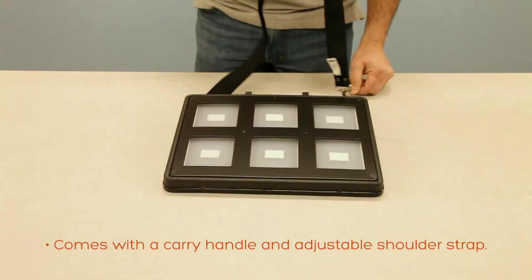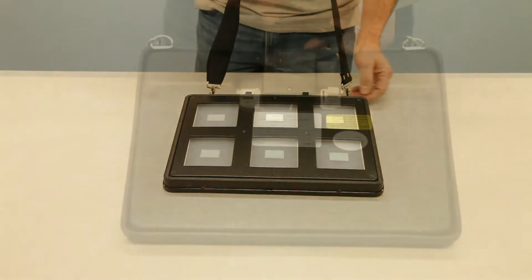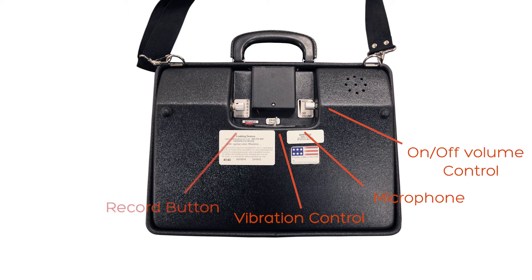It comes with a carry handle and an adjustable, removable shoulder strap. It's powered by four double-A alkaline batteries. You have your on/off volume control, microphone, a vibration function to give additional tactile feedback for someone who is also hearing impaired, a record button, and a level adjustment that you can set from one to six.